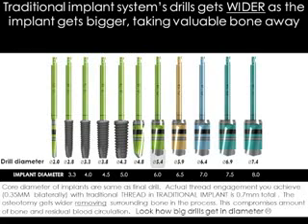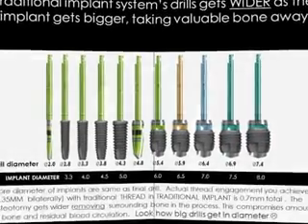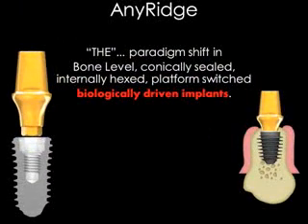People call it dieback, and so forth regarding different types of ridges, because as the implant size gets bigger, again, you're compromising your crestal bone at the top, therefore decreasing the valuable blood circulation in the area. Again, look how big the final drill gets for an 8mm implant. It's 7.4 millimeters. That's a lot of bone to be taken away.